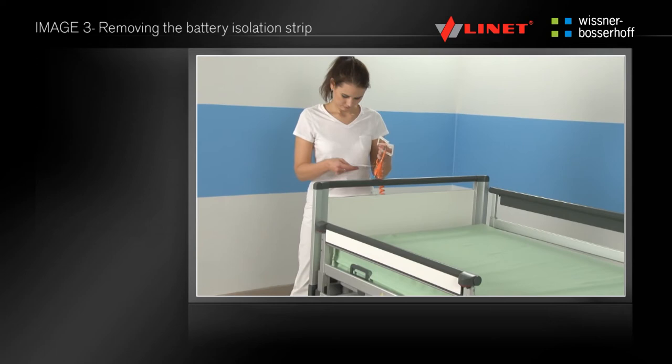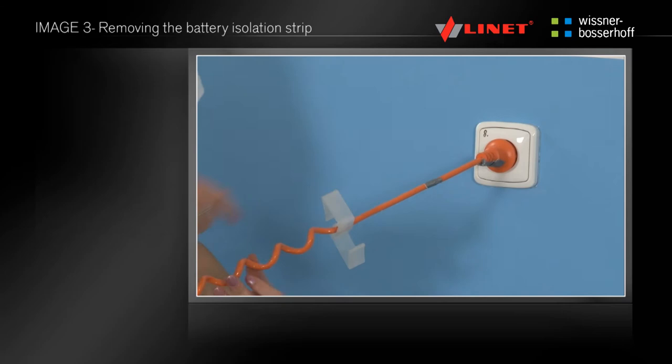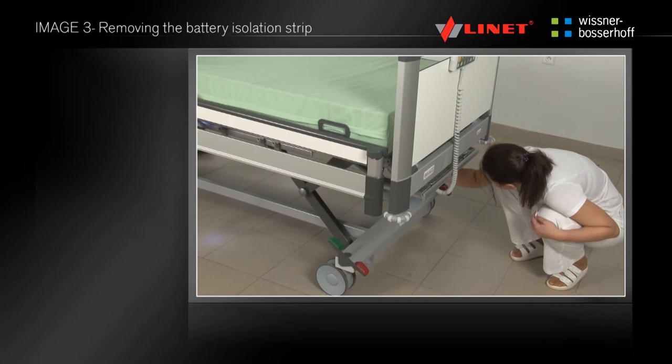Short instructions for removing the battery isolation strip are located on the power cable. Remove the instructions after reading and connect the bed to the mains. Then withdraw the insulating film which is located at the foot of the bed underneath the mattress platform.